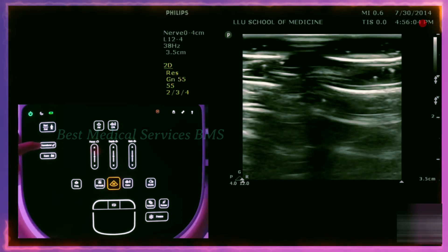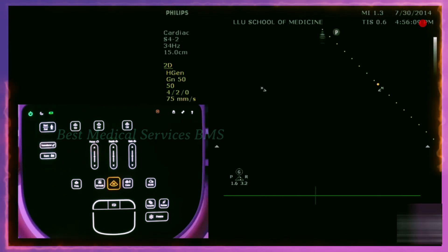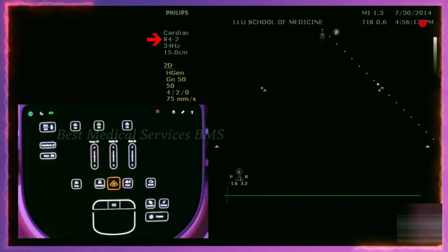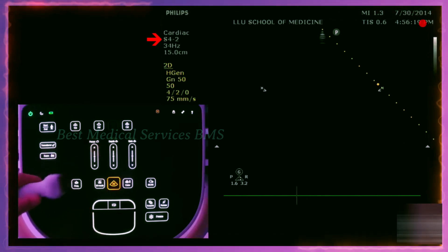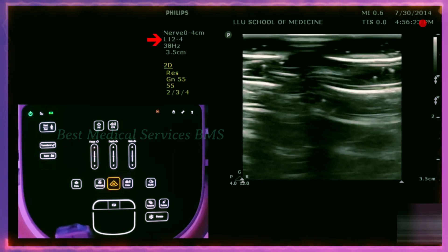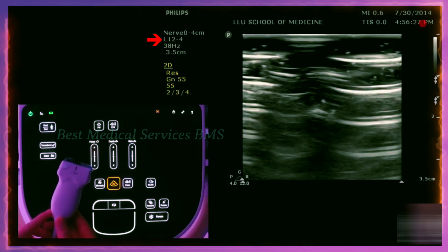Right here where it says transducer, it changes the transducer. If you look at the top left of the screen where it says S4-2, that is the type of probe — here you can see S4-2, switch to that. If I push the transducer again, it goes to L12-4, which corresponds to this transducer, L12-4.